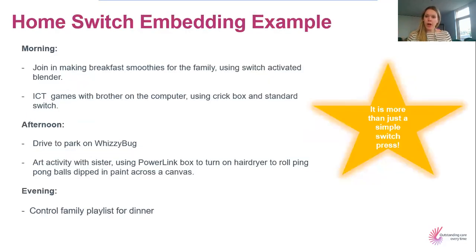So just an example of a home embedding switch example, just to give an idea, even with just a simple switch press, how much children can engage and achieve and participate. And that's kind of what our overall aim is. We're not aiming for children to have loads and loads of switches and be overloaded. We're just trying to get our message across that there's so much that you can do. We can reduce that physical demand, but we can actually increase that participation so much.